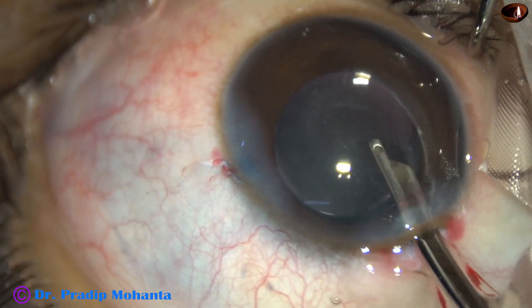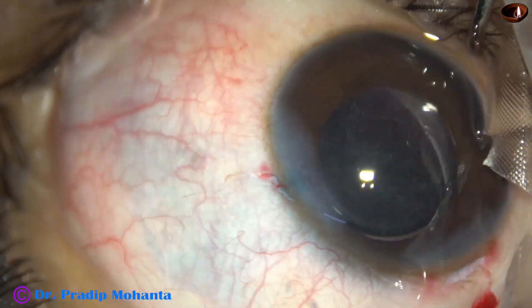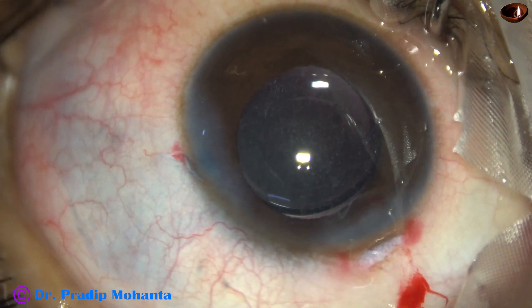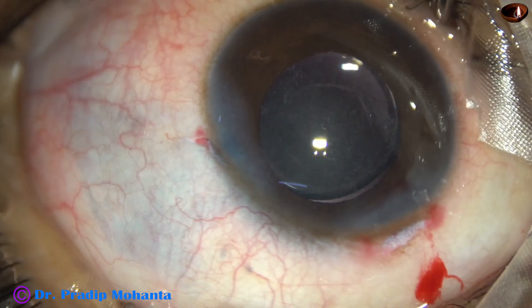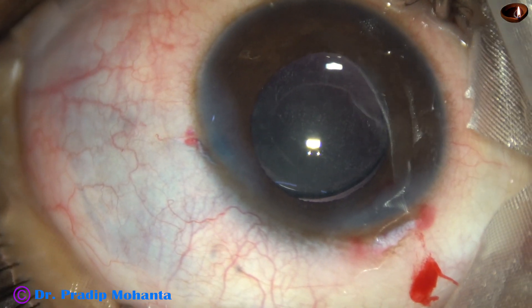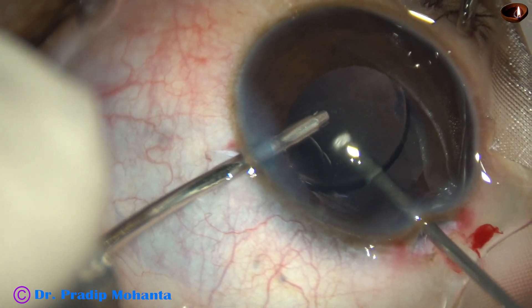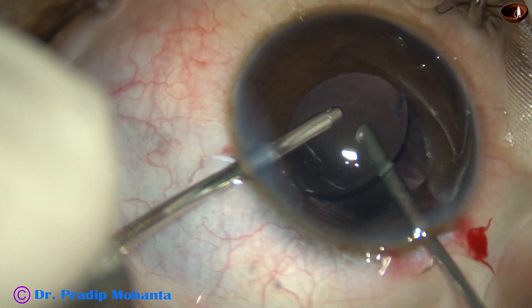One thing I notice is that a lot of triamcinolone molecules have traveled into the anterior vitreous cavity. There can be a rise in intraocular pressure, particularly if the child is a steroid responder. So I take the cutter again, go into the anterior vitreous cavity, and remove some triamcinolone acetate molecules using the vitrectomy cutter — with cutting and then aspiration, a lot of triamcinolone molecules came out.